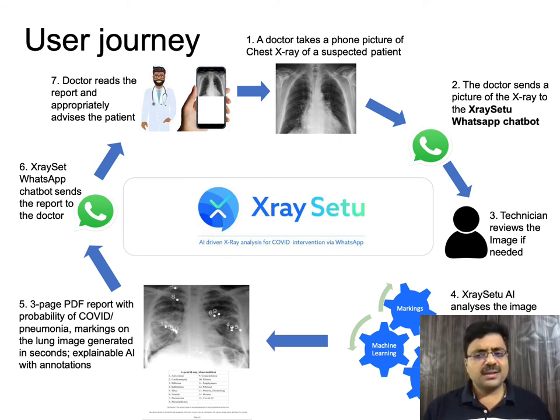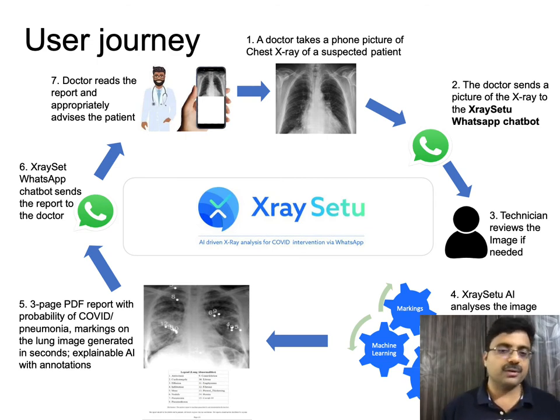The service is also very clearly positioned as a supplement to recognized and established means of diagnosis, such as an RT-PCR test or an HRCT scan result, and not as a standalone medical diagnosis service. The value clearly is just making the benefits of imaging and radiology more widely available and providing some sort of early interpretation of an X-ray.